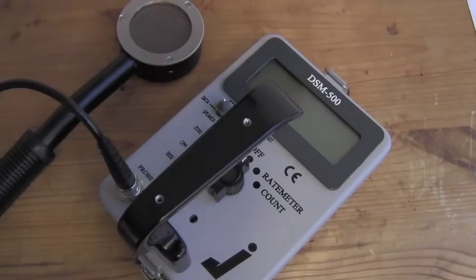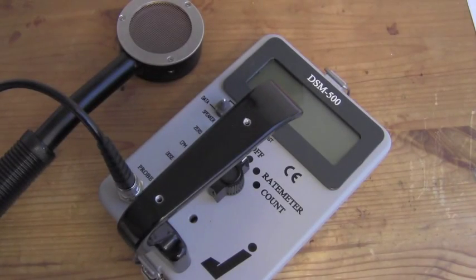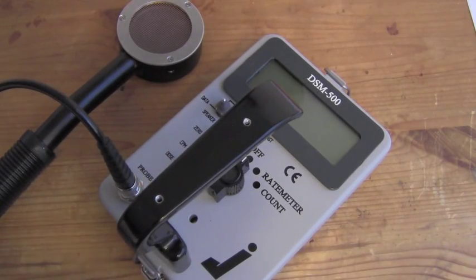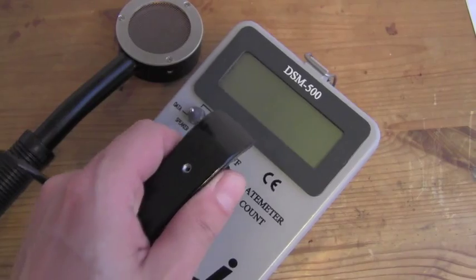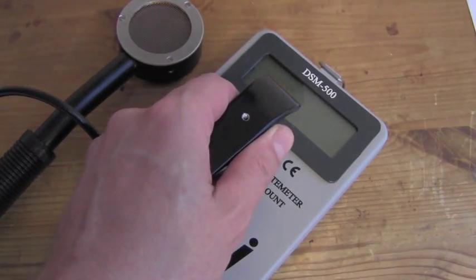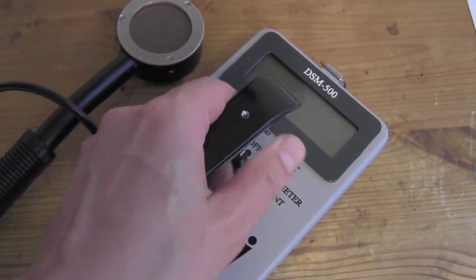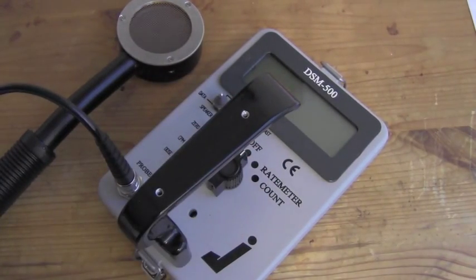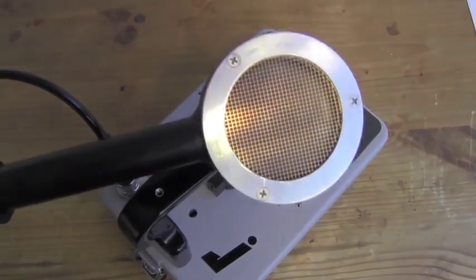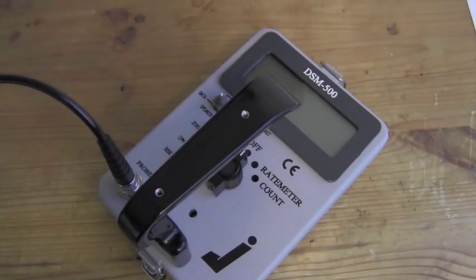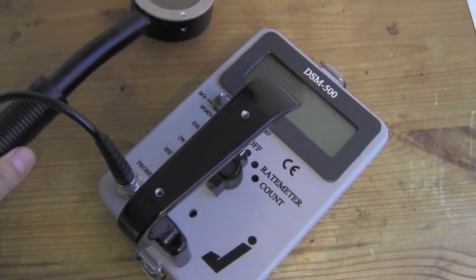We have sodium iodide scintillation probes, plastic scintillation probes which make the survey meter a nice micro-R meter, and an alpha scintillation probe. Today we are going to use our pancake GM probe for the demo.